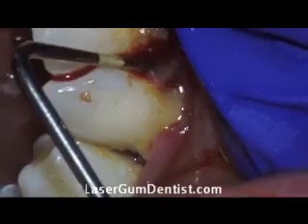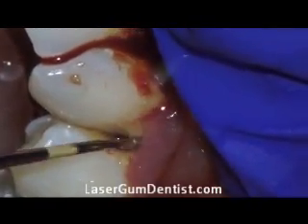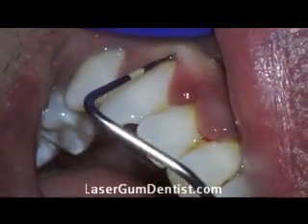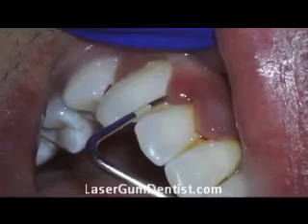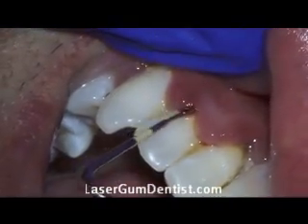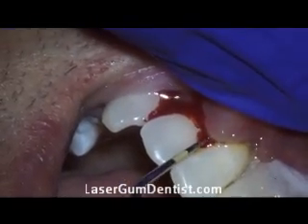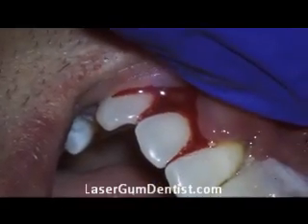Your gums should never bleed when we use this instrument. Whenever you go see a dentist, you want to make sure that they take these measurements every year. If they don't, maybe it's time to find a new dentist, because gum disease is the number one cause of tooth loss. You're going to your dentist to help you keep your teeth, and if you want to keep them you want to make sure your gums are healthy.